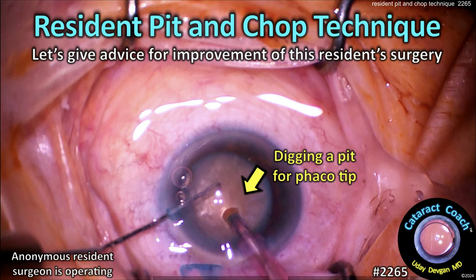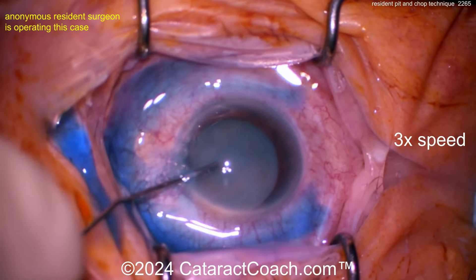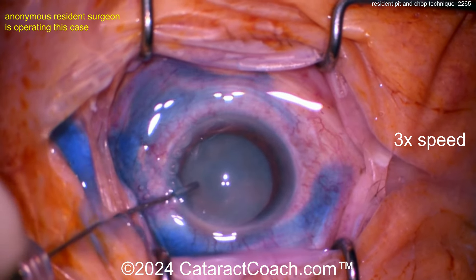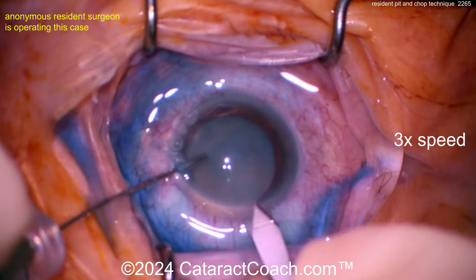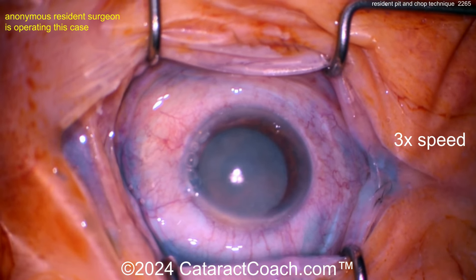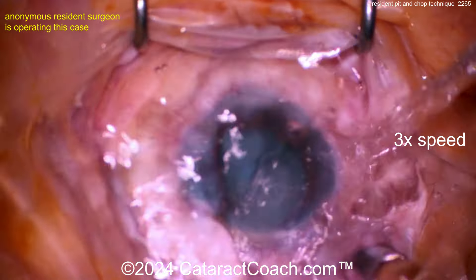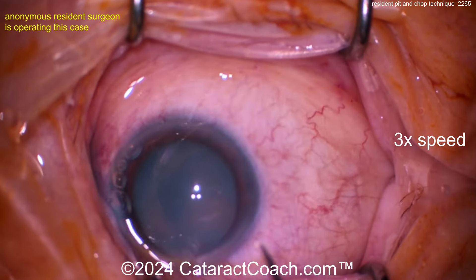cataractcoach.com resident pit and chop technique — let's give some advice for improvement for this resident surgery. Pretty good cataract there, trypan blue dye going in. Surgeon sitting superiorly, holding with the viscous cannula. Here's the incision, that all looks pretty reasonable. Let's see that rhexis now. It does not look like an intumescent white cataract, so I don't think we'll have an Argentina flag sign.